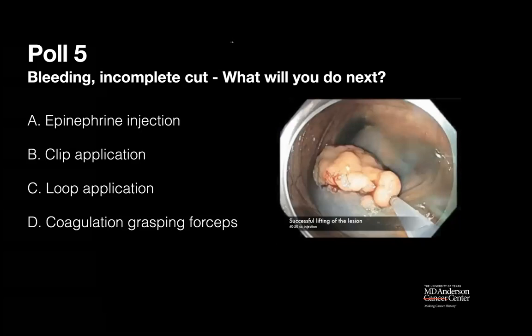Are you going to take epinephrine? Although we used epinephrine in the solution initially. Or apply a clip, or use a coagulation grasping forceps, or a loop. So while the poll is going, okay. Roy, what would you do?